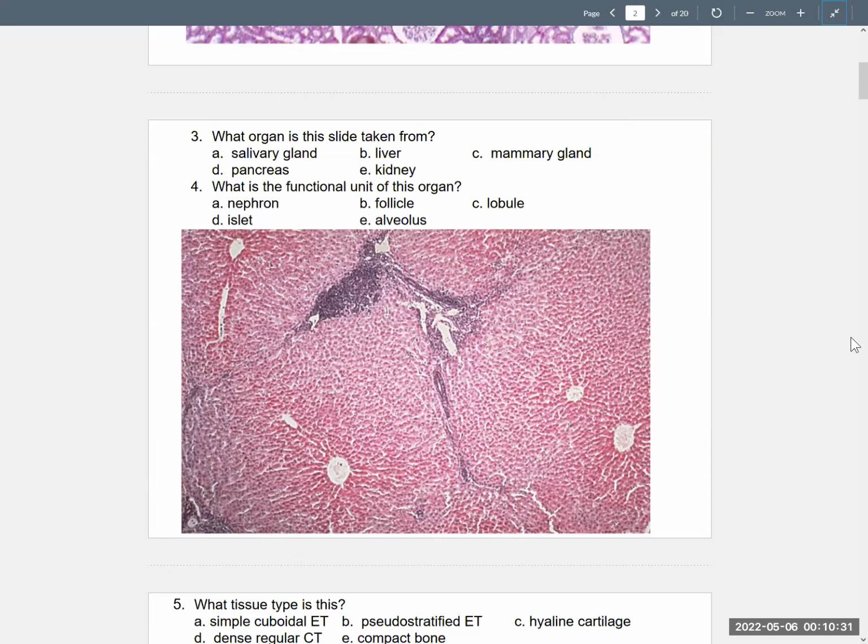Liver. And I, in my mind, would think, what's that? Oh, central vein. Well, that's the end of it. It's the liver. But here are the tile-like lobules that we see cut across.